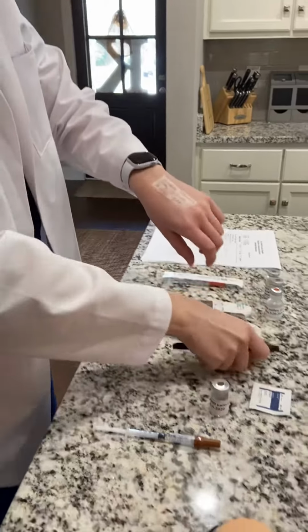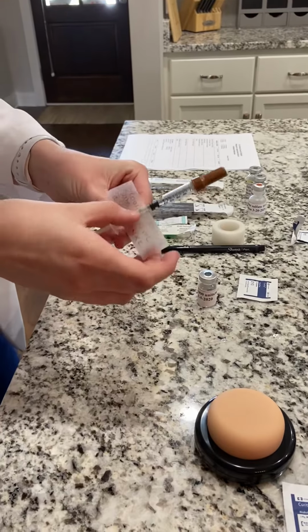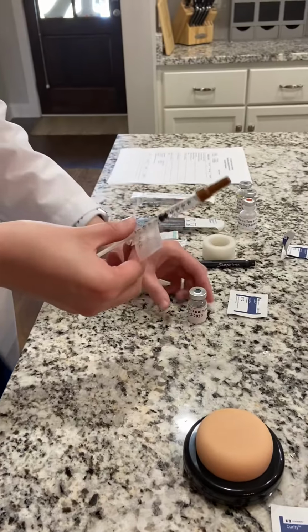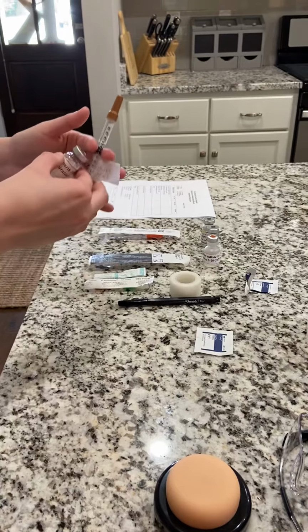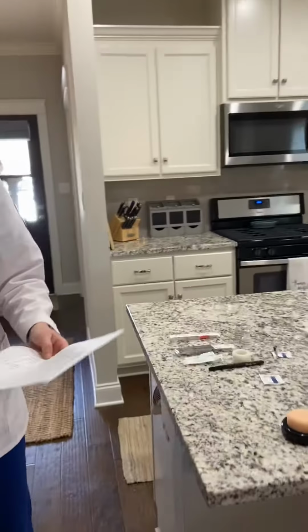I'm going to put this onto the syringe. Okay, now I'm going to take my syringe, my vial, and my MAR and chart with me, and now I'm going to enter the patient's room.